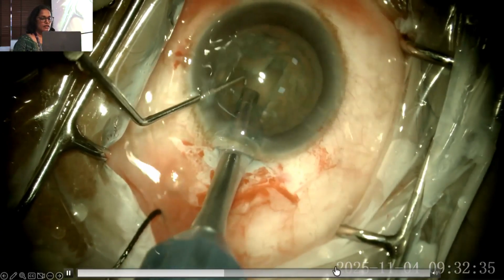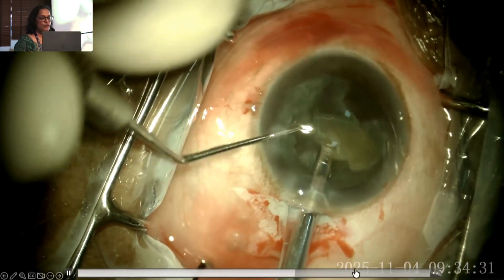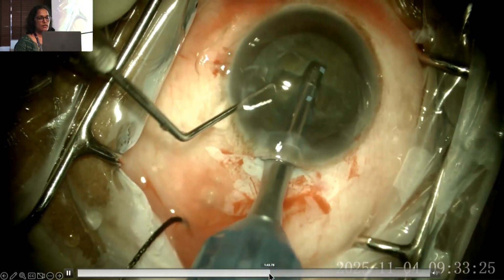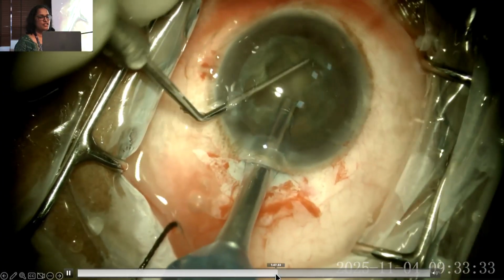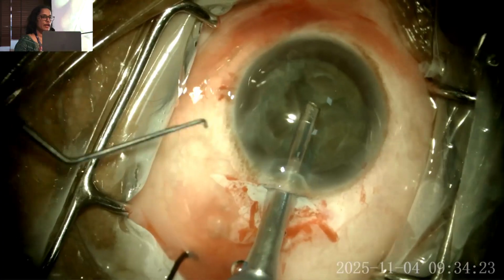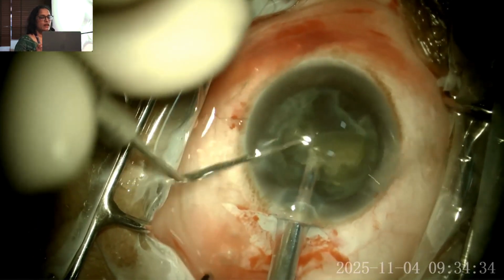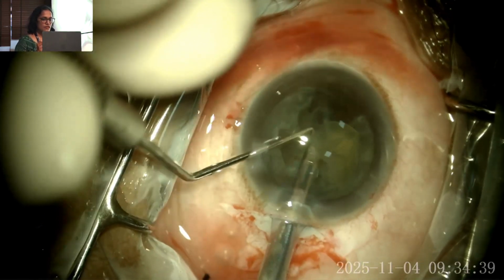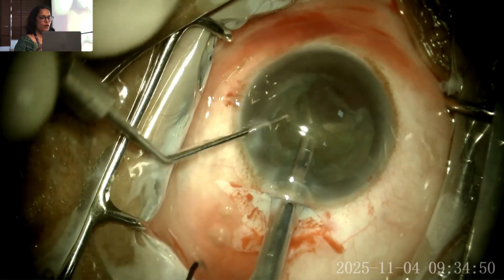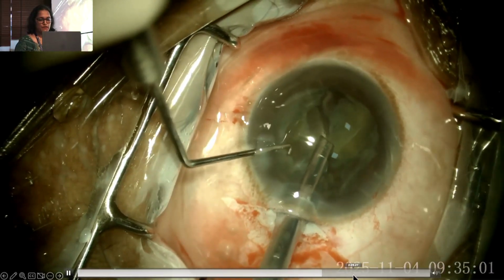After the trenching and dividing, we know the instruments have to be at the bottom of the trench. After dividing into four quadrants, it is just a piece of cake, taking out the pieces one by one. We have to follow certain rules, like never go to the periphery, never chase after pieces, and stay in the central 4 mm safe zone, etc.